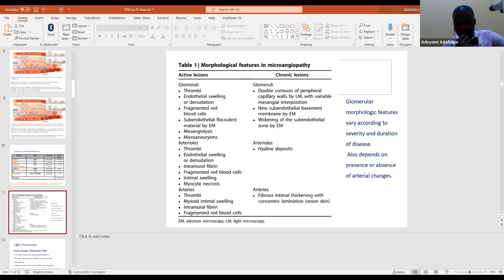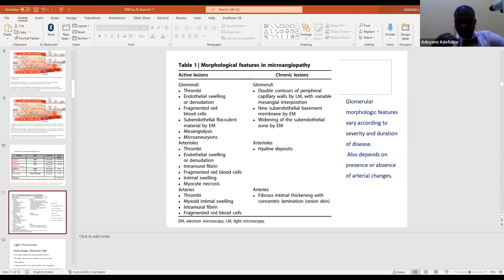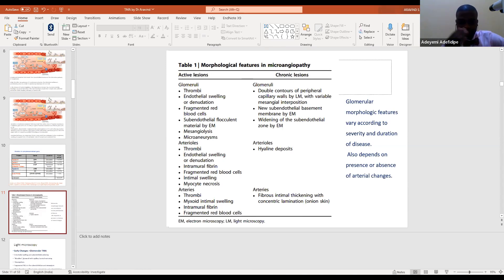A question was raised about how to differentiate ANCA vasculitis and fibrinoid necrosis due to TMA that involves only arterioles. The key differentiating feature is that in TMA-related fibrinoid necrosis, although fibrin is present in the lumen and wall, there is no significant inflammation in the wall. If you find inflammation in the arterial wall, you should think of ANCA-mediated vasculitis. Absence of inflammation is the clue that we are dealing with TMA rather than vasculitis.